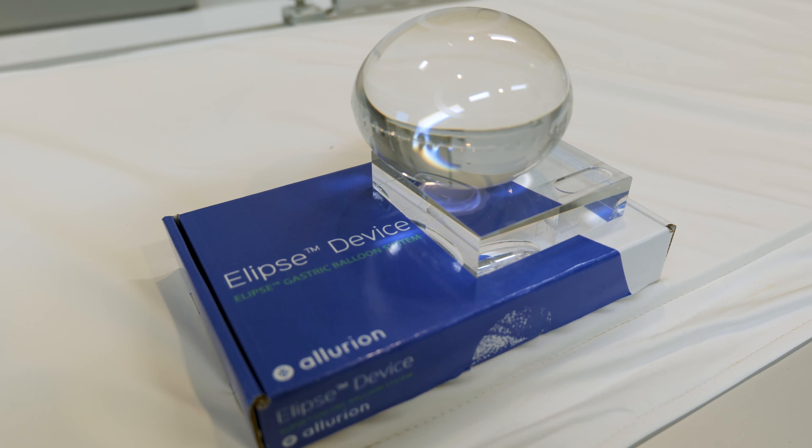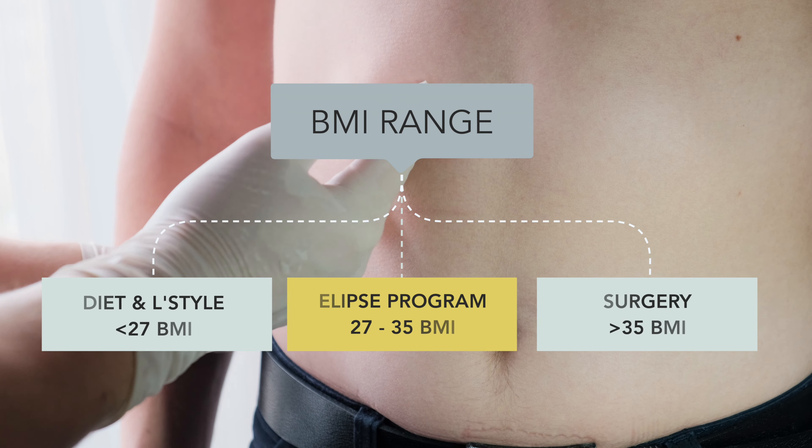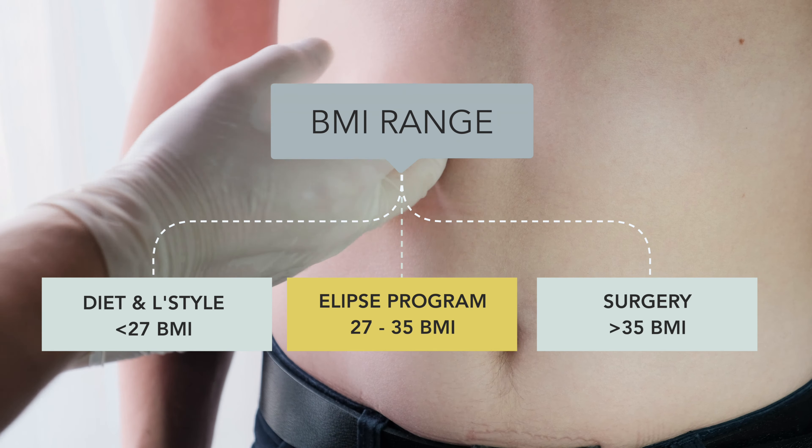My name is Dr. Arun Deer. I'm a gastrointestinal and bariatric surgeon, and today I'm going to be introducing you to this new piece of technology that is in the market to allow a weight loss option for individuals who are in the BMI range of 27 to 35.